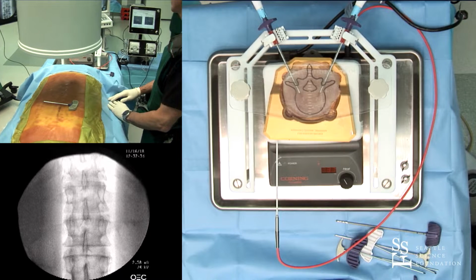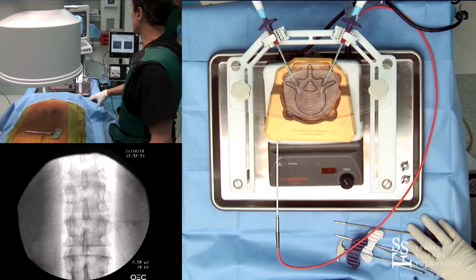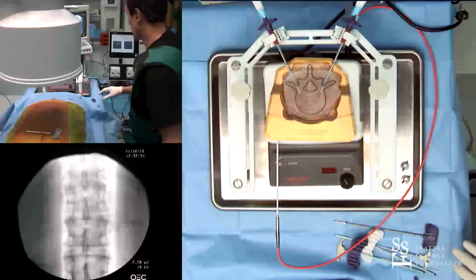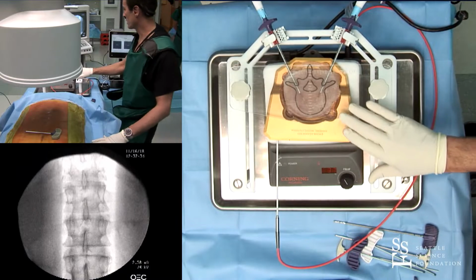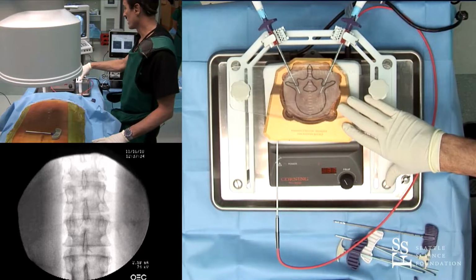Okay, so we are going to talk about tumor ablation for vertebral augmentation, kyphoplasty, and tumor ablation. During this session, we're going to have a demonstration with a chicken breast right here for tumor ablation. And this model is going to run for about 15 minutes. And so we're going to turn this on presently.